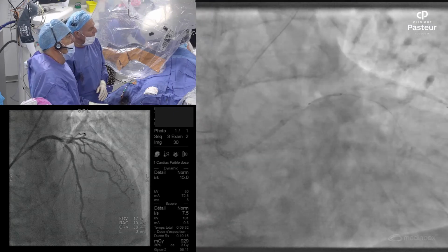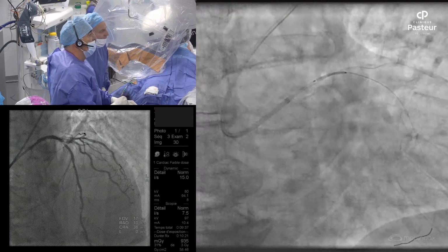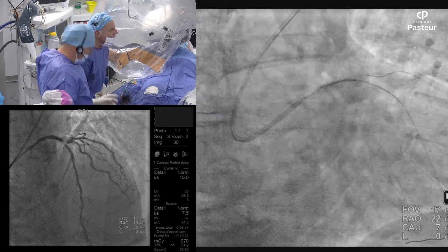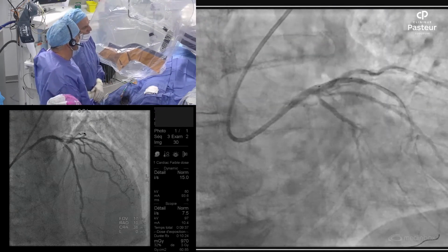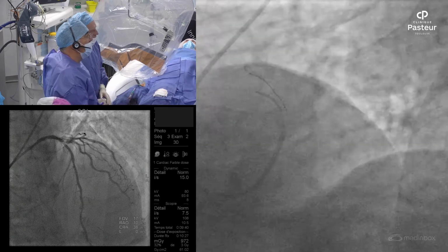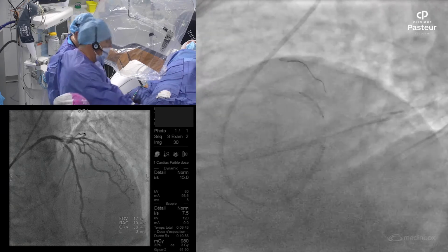We will check in this view if we are correct regarding the left main. Let's see. I think that probably it's okay. Here is okay. We are before the bifurcation. But what we can do is to use the spider view. In spider view, that was a very nice view, in order to see the LAD proximal to the bifurcation and the bifurcation. So we could maybe see something like that. Yeah, that is correct. Okay.